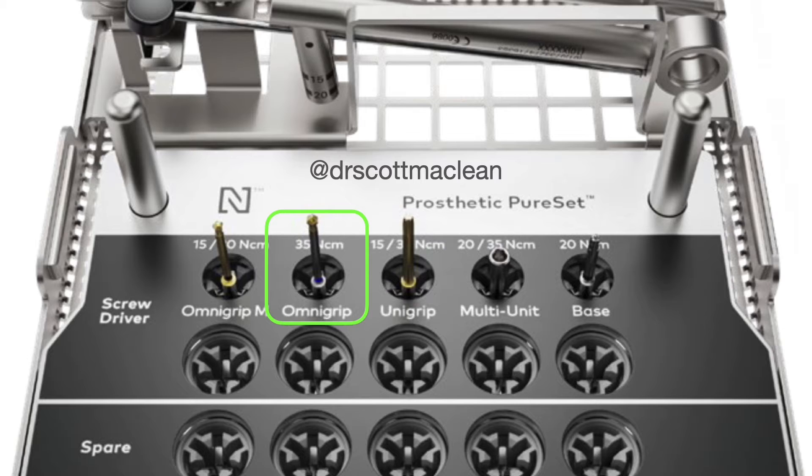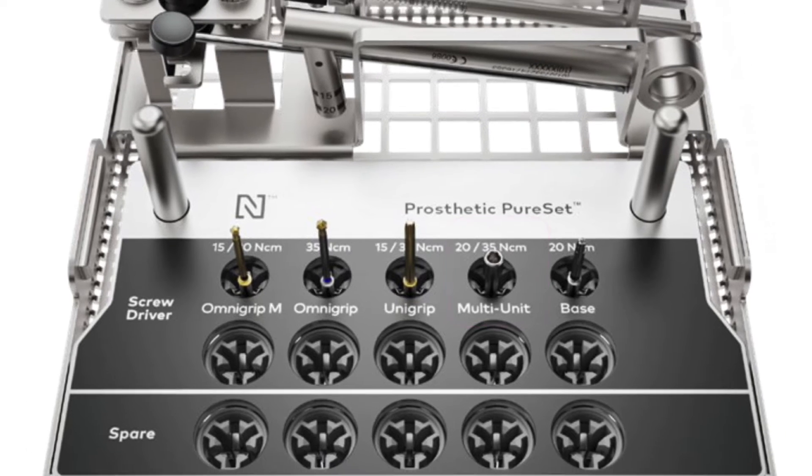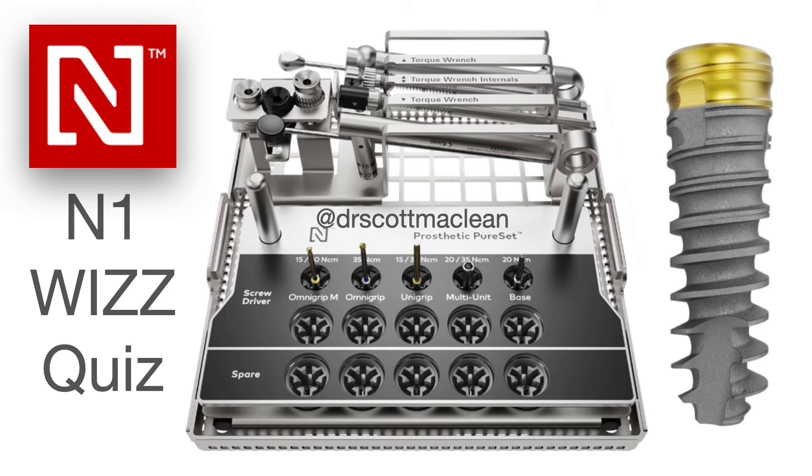On the Pure Set kit we also have the OmniGrip driver, which is used for conical connection angular screw channels. We also have the UniGrip driver, which is used on more traditional healing abutments and on some of the systems prior to the conical connection. Then we have the multi-unit driver, which is often used in All-on-4, though you do have to use some of the new drivers for All-on-4 on N1.